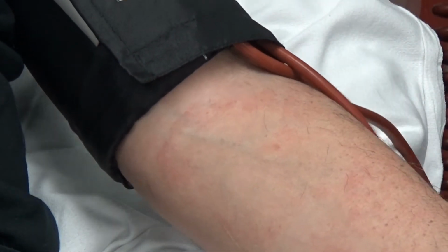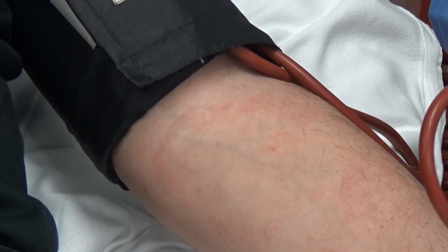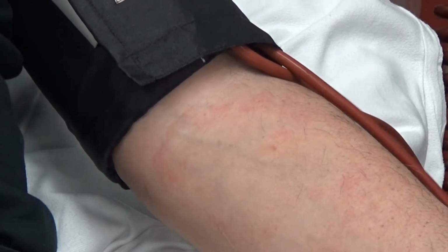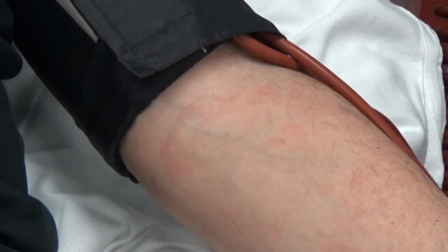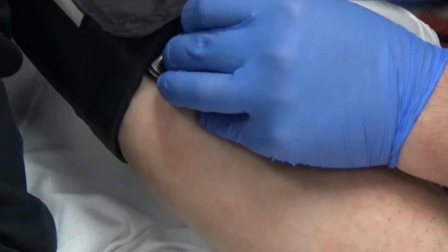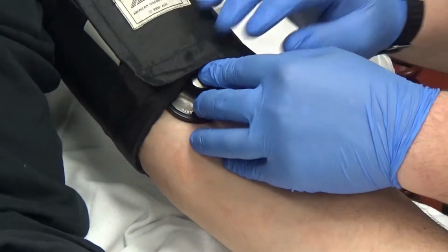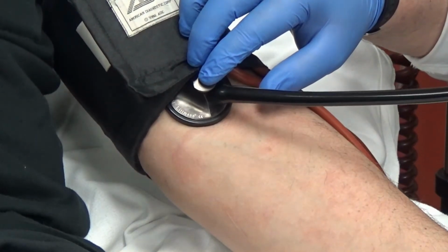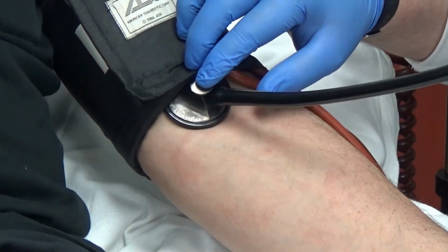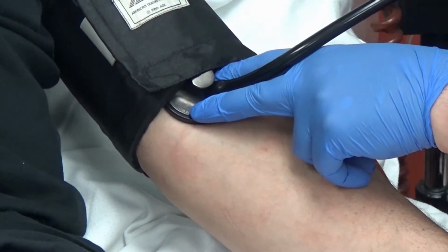So then from there, what you're going to want to do is make sure that your cuff is closed here, okay? Then I'll place my stethoscope on the brachial artery. And I can hear it here, okay? So typically what I'll do is I'll pump the blood pressure cuff up, as you can see over here.